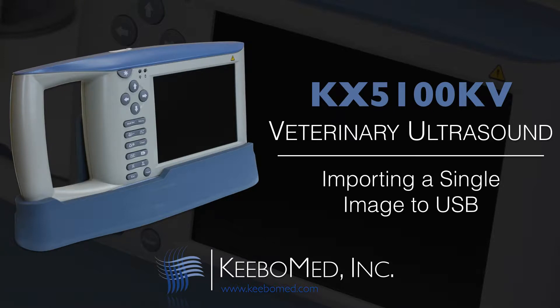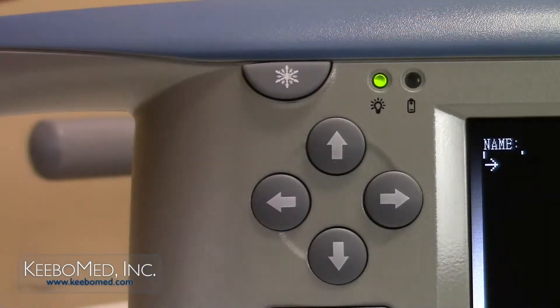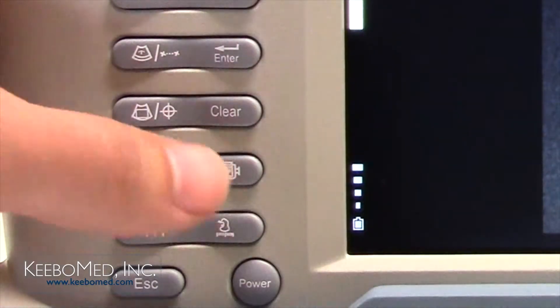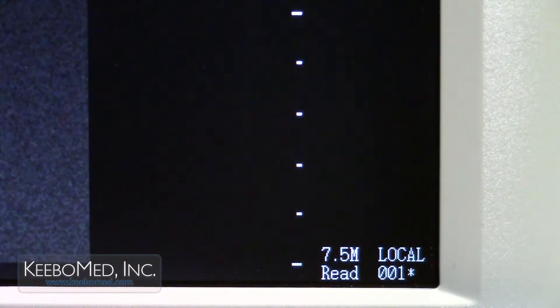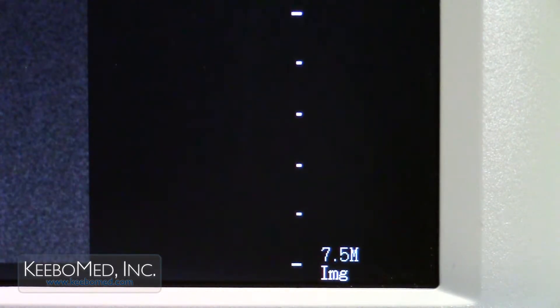Importing a single image from the ultrasound system to a USB drive can also be easily performed. Step 1. Insert a USB drive into the USB port on the side of the ultrasound. Step 2. Press the freeze key to freeze the image. The letters FRZ will appear on the bottom right corner of the screen. Step 3. Press the save key twice. A read prompt will appear on the bottom right of the screen. The word local is also displayed. This indicates that the image is loading from the system. Step 4. Press the enter key and a wait prompt appears as the image is loading. Once the image is loaded, the letters IMG will be displayed.